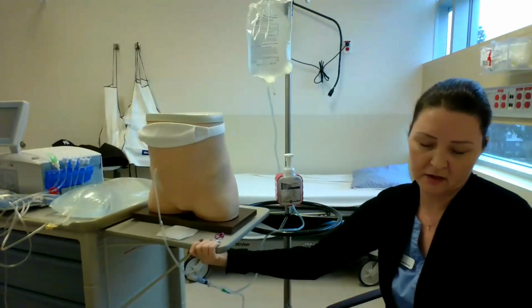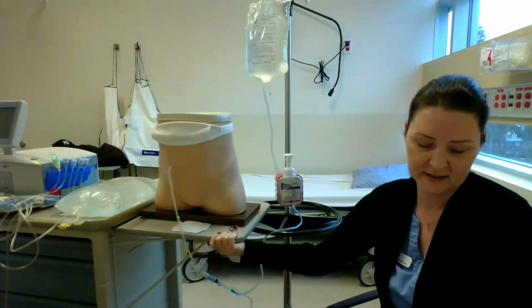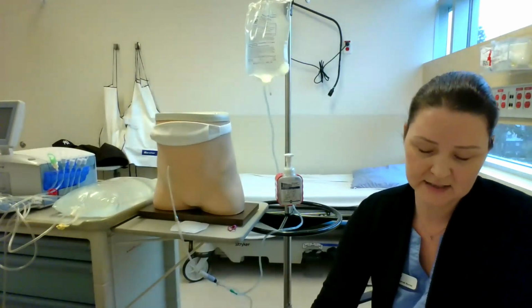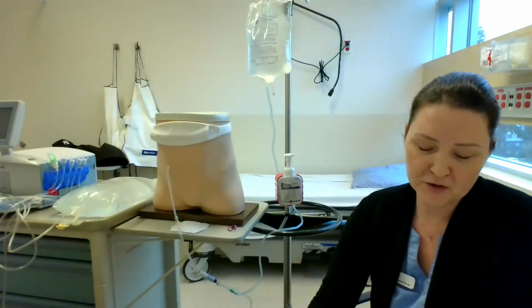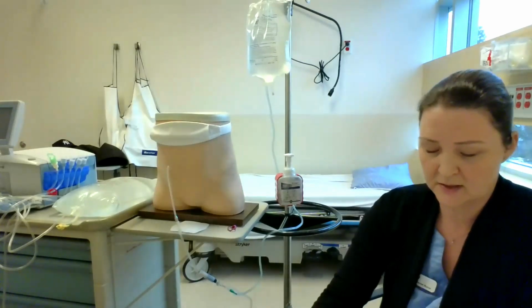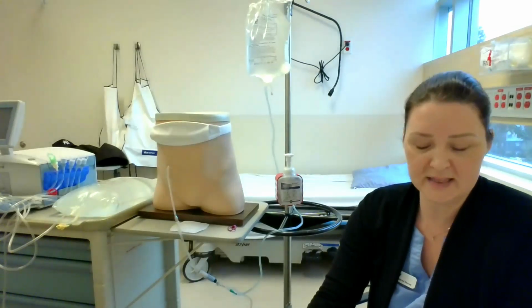Four exchanges are performed each day. Each exchange takes approximately 30 minutes. Each fill volume is approximately 2 liters to 2,500 mils. And there's always fluid in the abdomen.